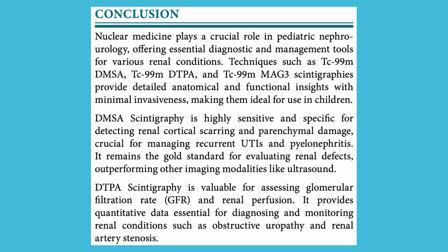DMSA scintigraphy is highly sensitive and specific for detecting renal cortical scarring and parenchymal damage, crucial for managing recurrent UTIs and pyelonephritis. It remains the gold standard for evaluating renal defects, outperforming other imaging modalities like ultrasound. DTPA scintigraphy is valuable for assessing glomerular filtration rate, GFR, and renal perfusion. It provides quantitative data essential for diagnosing and monitoring renal conditions such as obstructive uropathy and renal artery stenosis.